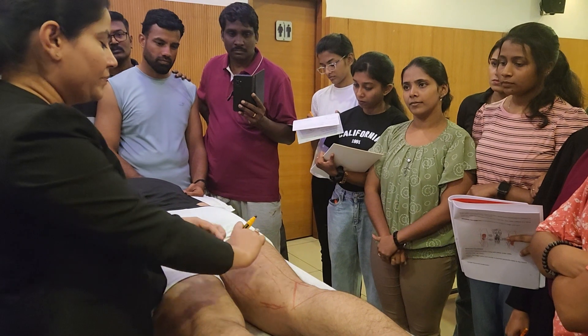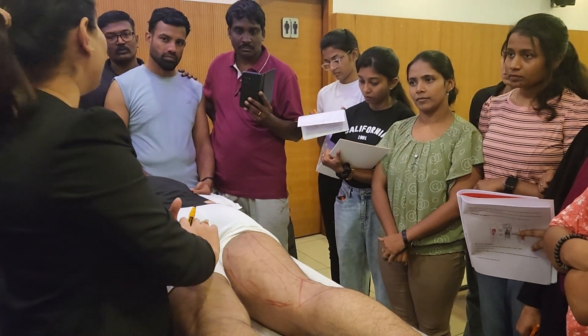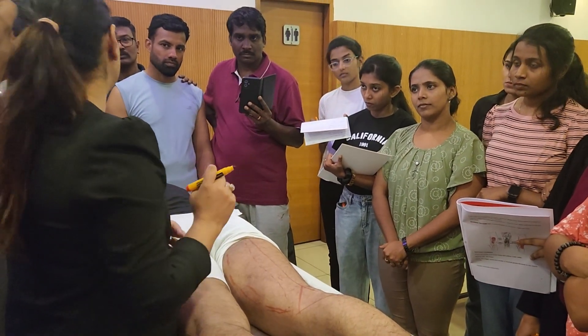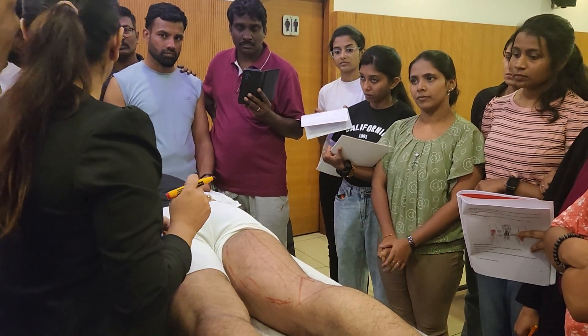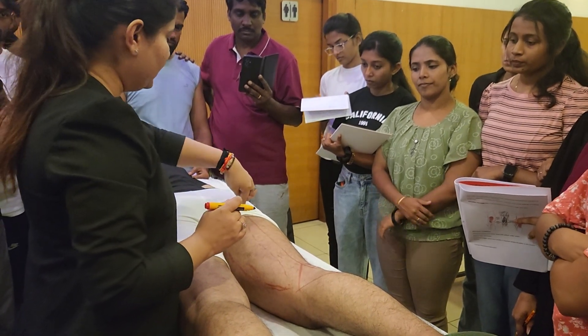In the whole hamstring, you will get 8 to 10 trigger points — randomly, 8 to 10 trigger points.